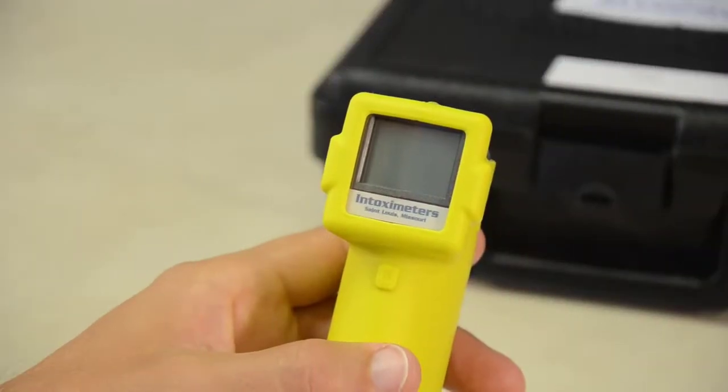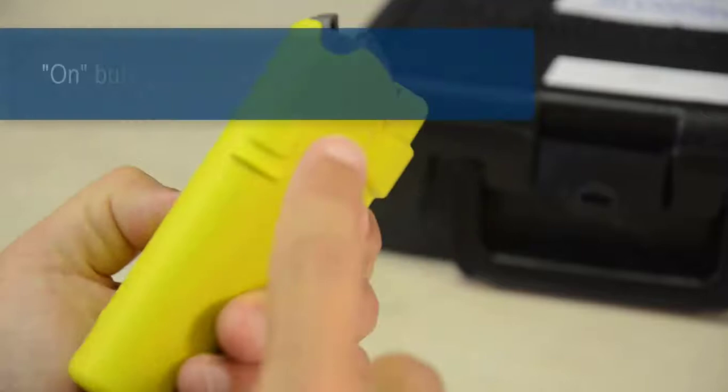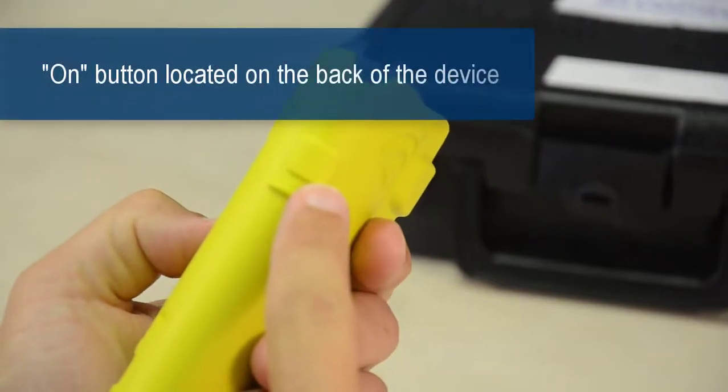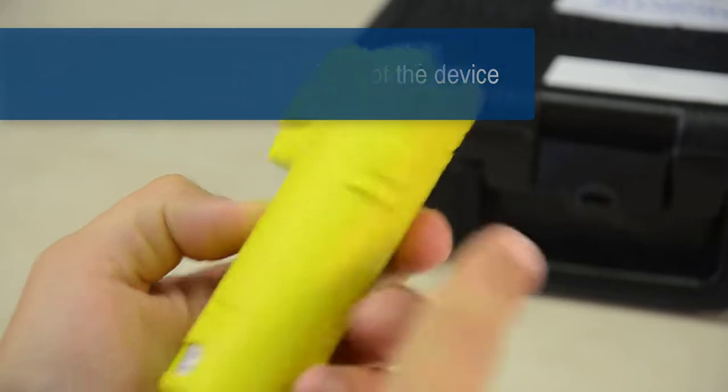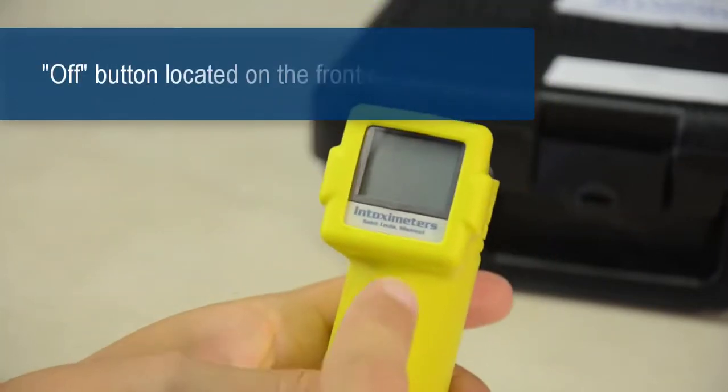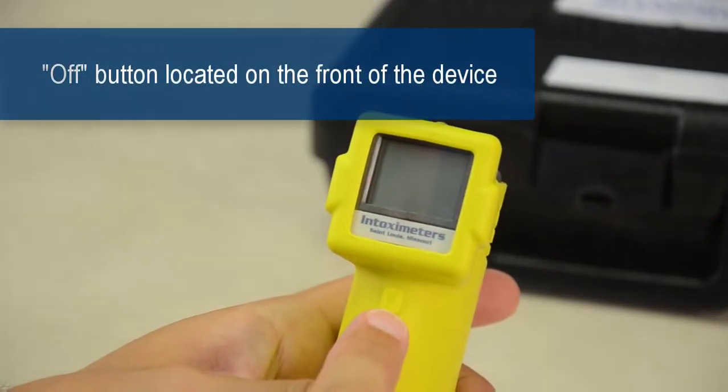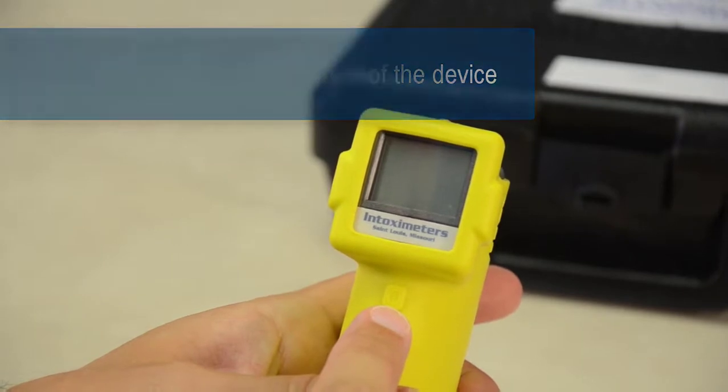There are two buttons on the device. The On button is located on the back of the device and can be activated using your trigger or index finger. The Off button, which is located on the front of the device, can be easily depressed using your thumb.